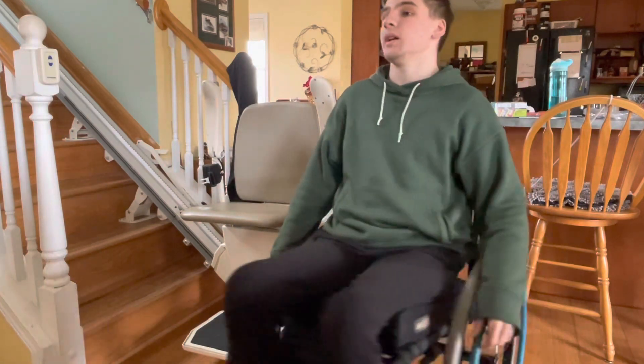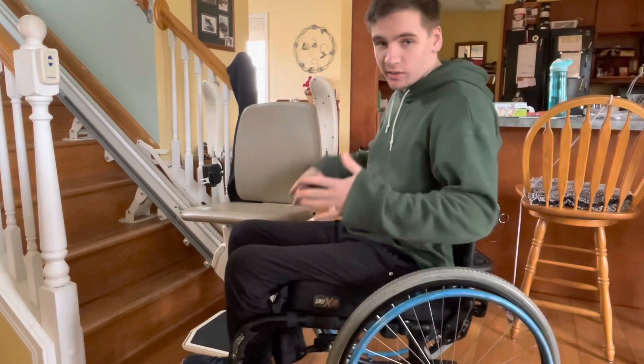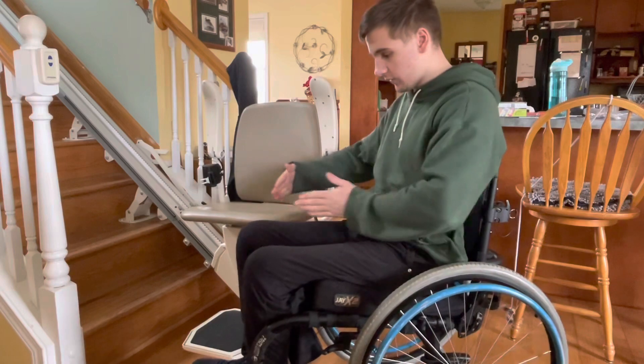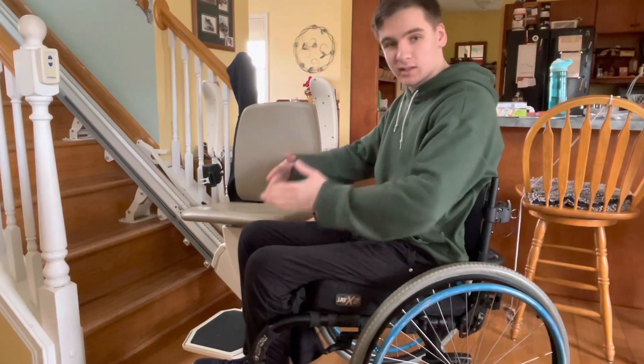How you should be transferring is at an angle. I like about a 90-degree angle, but really anything from about 45 degrees to 90 is good.